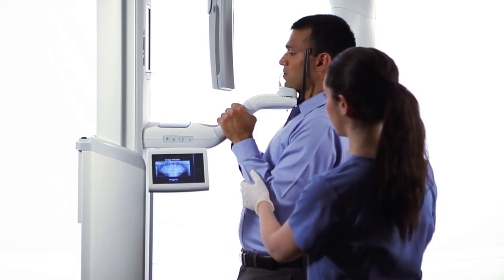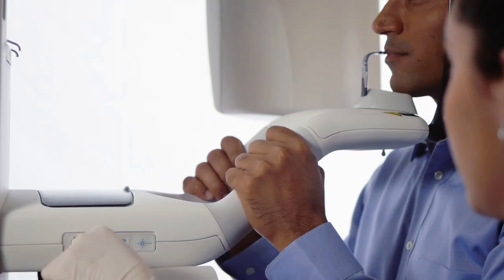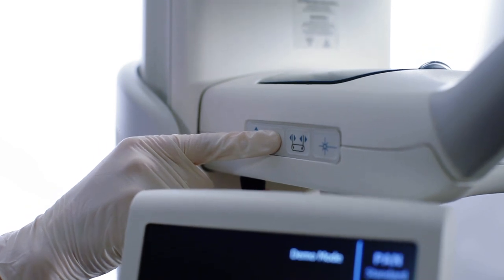Ask the patient to stand at full height and relax the shoulders. Adjust the vertical height of the positioning table using the two control buttons and place the patient's anterior teeth in the bite piece grooves.